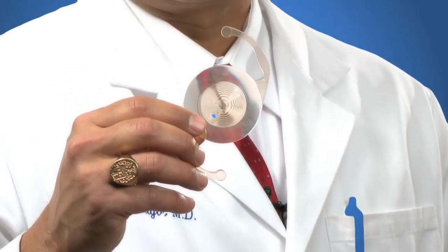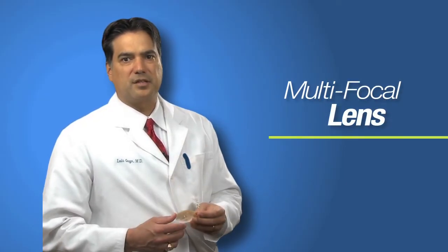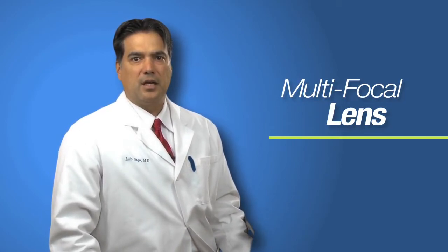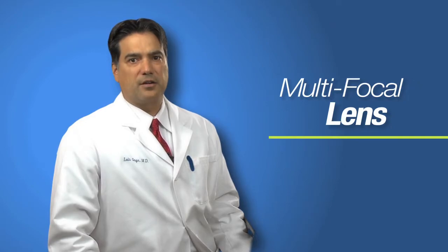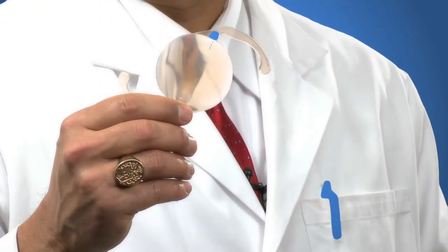As a patient and consumer, you have many implant options available to you. The first implant option is the multifocal lens. It is designed to provide you with more youthful vision. I tell my patients that they will be out of their glasses for 80 to 85% of the things they do during the day. You still may need a very minor pair of glasses for night driving or very small print.